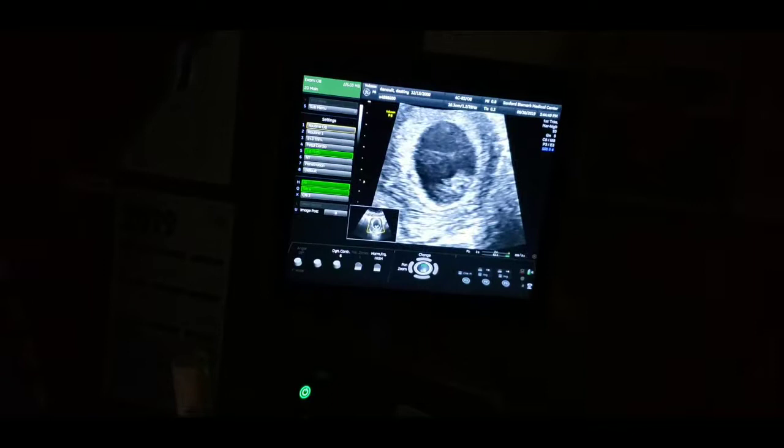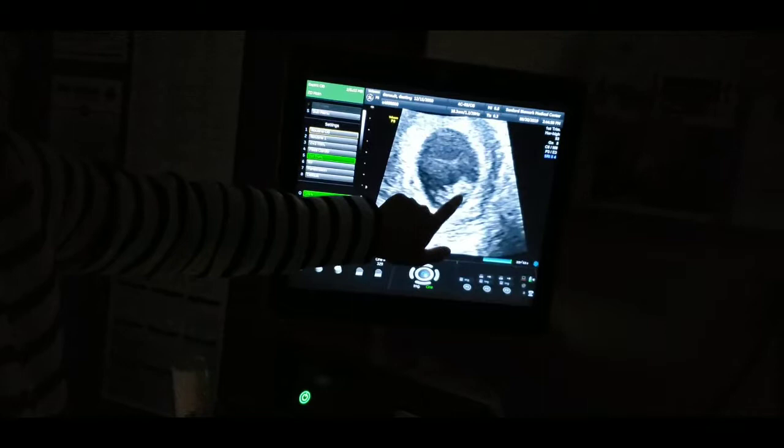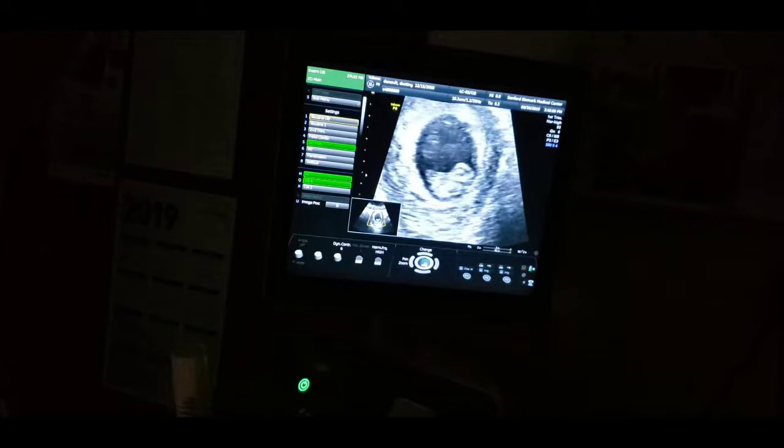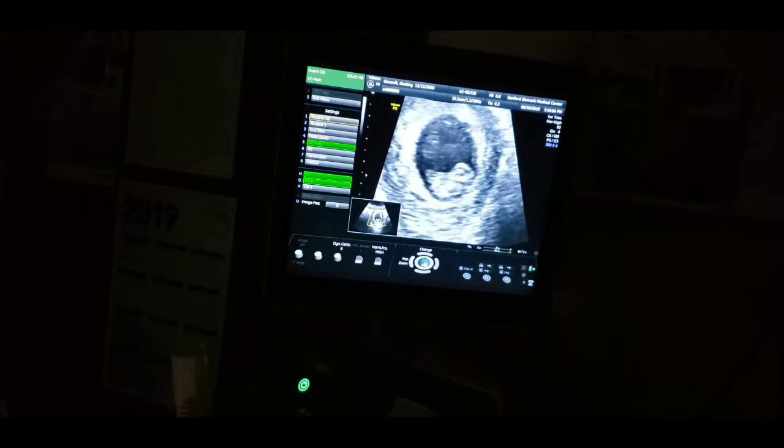So it's a little bit blurry, but you can kind of see — basically this one's going to be the head. You're going to start to see the very beginnings of what are going to be arms right there, and then the very beginning of legs are going to be here, and that's the ultrasound all the way through.